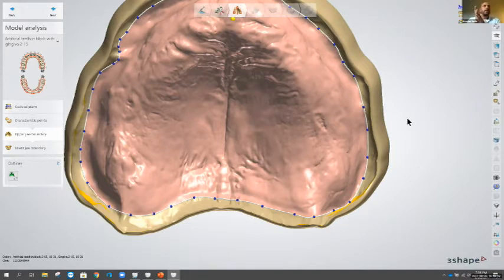No. So with a patient who's edentulous, has no dentures, nothing pre-existing, there's a device from Ivoclar called the centric tray. You could take your vertical dimensions in that, and then you could use custom trays or a direct intraoral scan to capture the upper and lower arches. That will allow you to align them in the software and get the proper VDO there.